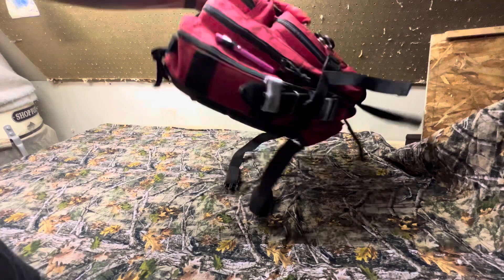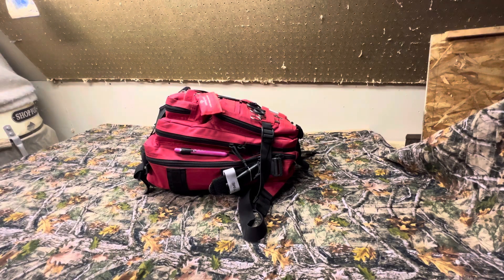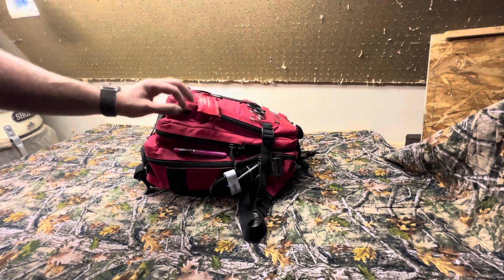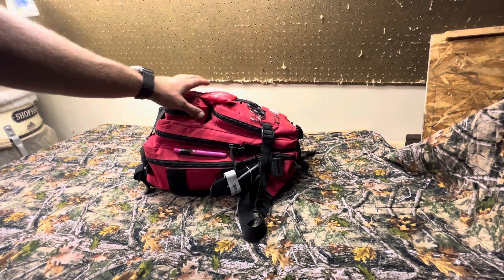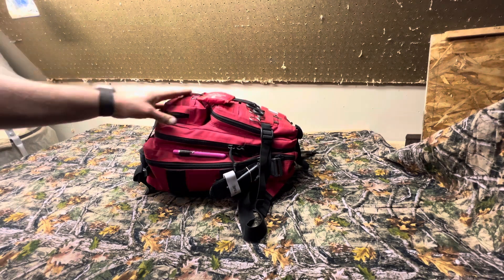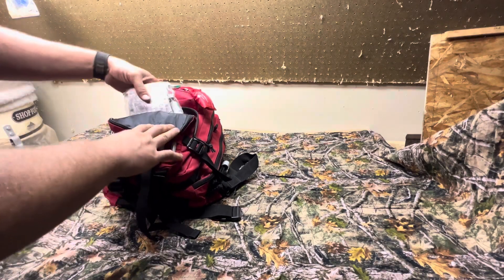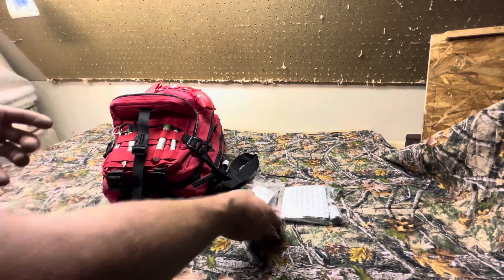Going into the actual pack itself, I've got it isolated into three separate sections. In the main one is advanced bleed control, in the secondary is general health, then we've got a boo-boo kit and some extras that you may not think about having in your family emergency kit — but once you see what it is, you're going to ask yourself why don't I have some of that? So let's go ahead and get into the boo-boo kit section.